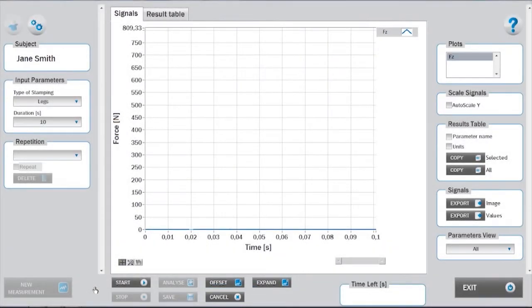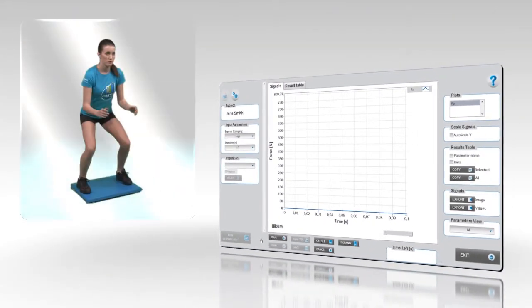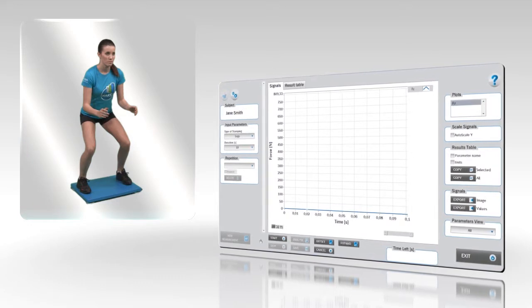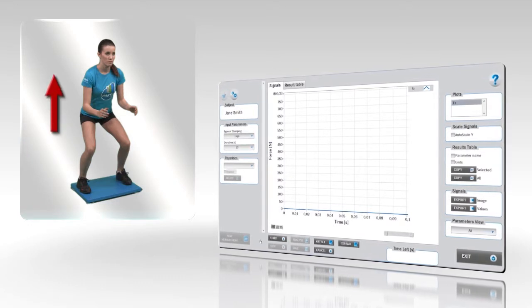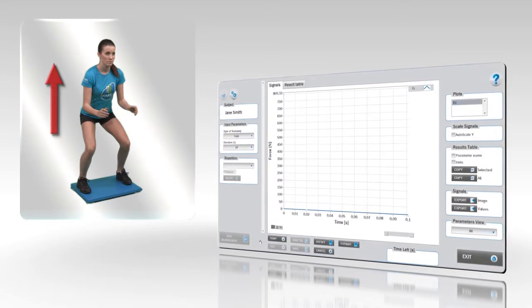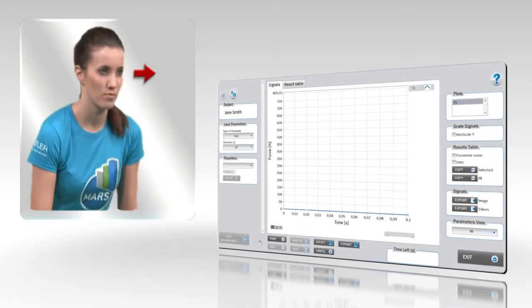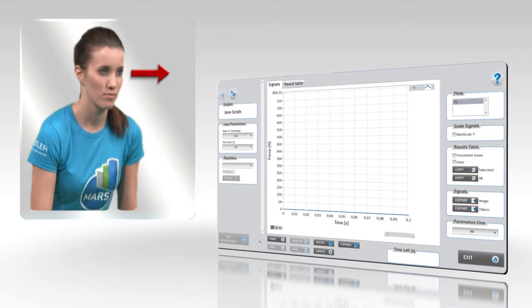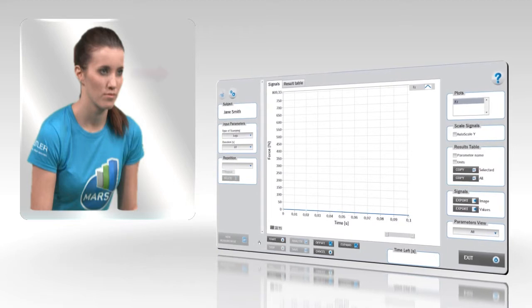Before starting with the measurements, the subject should assume an appropriate initial position, that is standing with slight flexion in the knees and hips and with eyes directed forward.